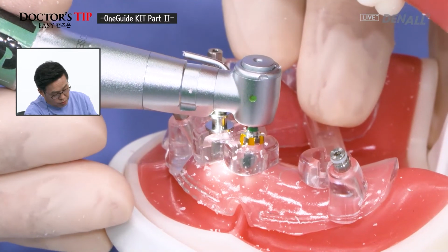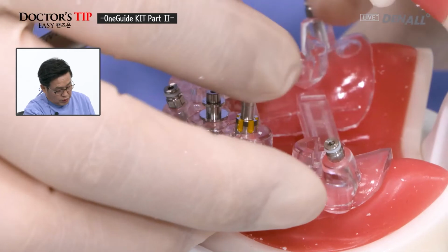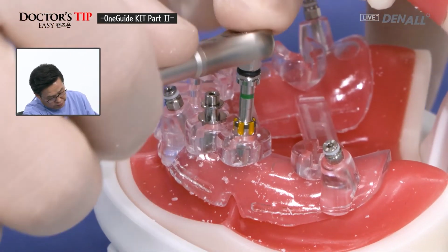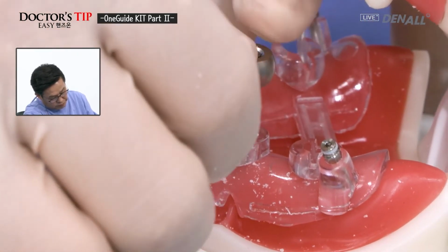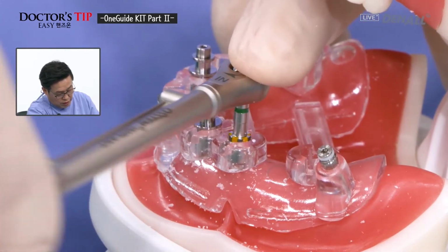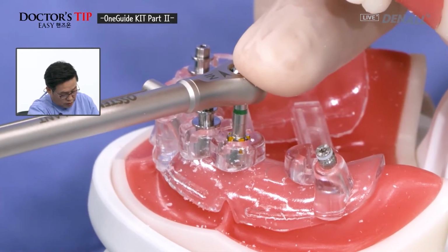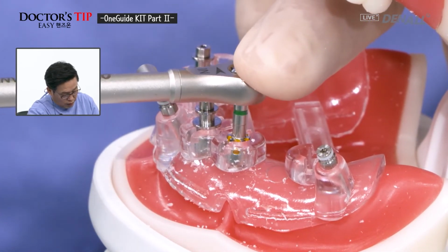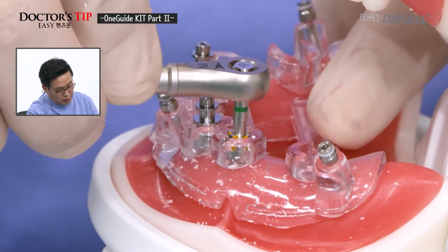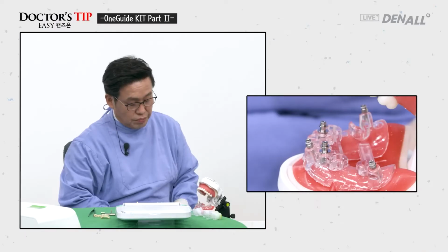Approximately 80% has been connected, and then use hand wrench and with fixture driver connected as shown. Template hole and yellow needs to fit well. Depth control and hex control is done. Final. So 30 Newton centimeters. So they're all removed.